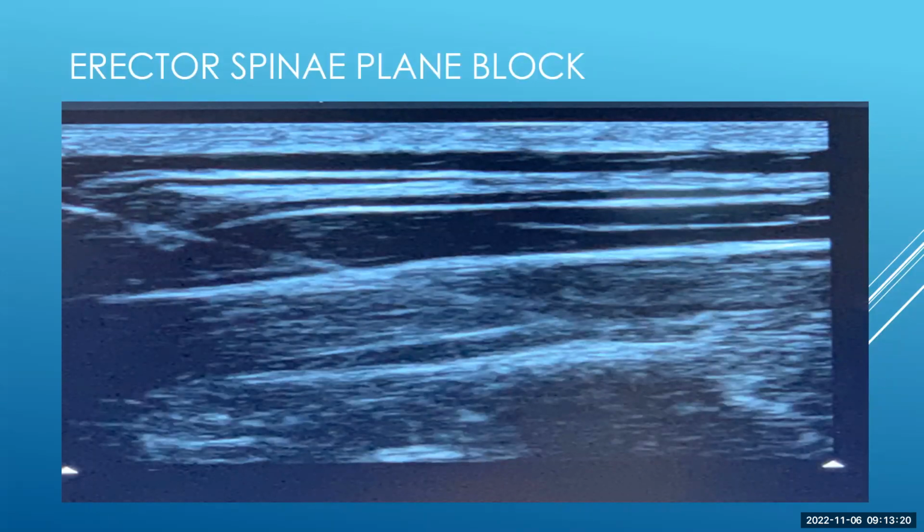So it's a bit of a best case scenario. And so again, we can see our needle here. I'm going to just annotate that for us there. We can see that. And then we can see the tip right in this area. But we also can see this really bright line right here, right? And that's the bone. And so in this scenario, this is a erector spinae plane block. That's the transverse process. It's nice and boxed in. It's not round where it's quite the rib.